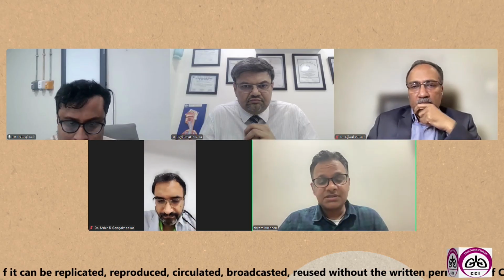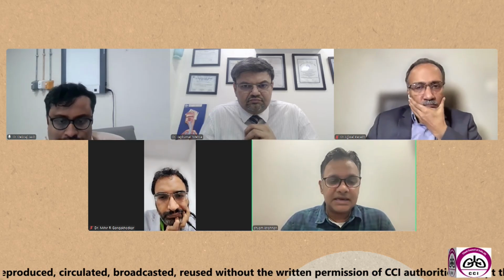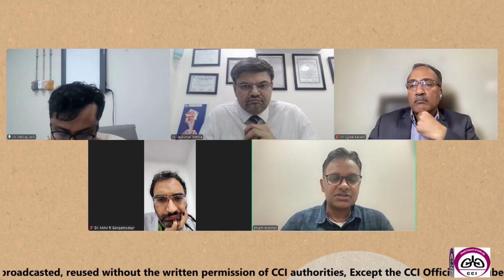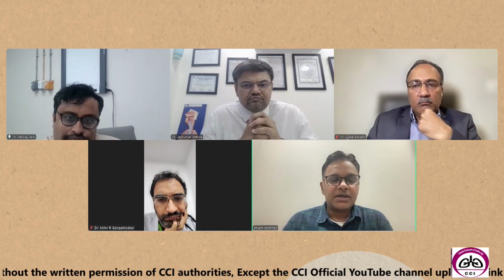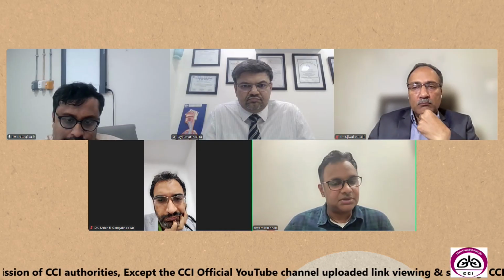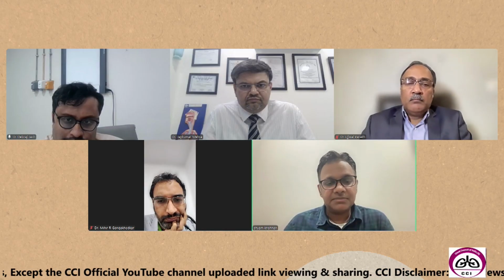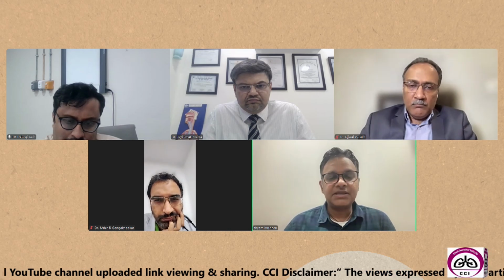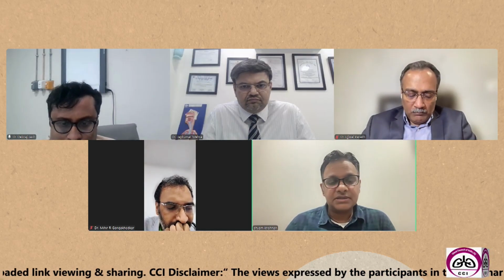In the EBUS procedures, initially I just start with identifying the landmarks, and I usually do it with the LMA. Because that way you get time to teach. If the patient is coughing under conscious sedation, you always have a time constraint and wouldn't be able to teach well. So whenever it's a teaching case and the patient is fit for general anesthesia, I usually post it as a case with an LMA under a GA. Then I can actually teach my students the knacks of doing the EBUS.